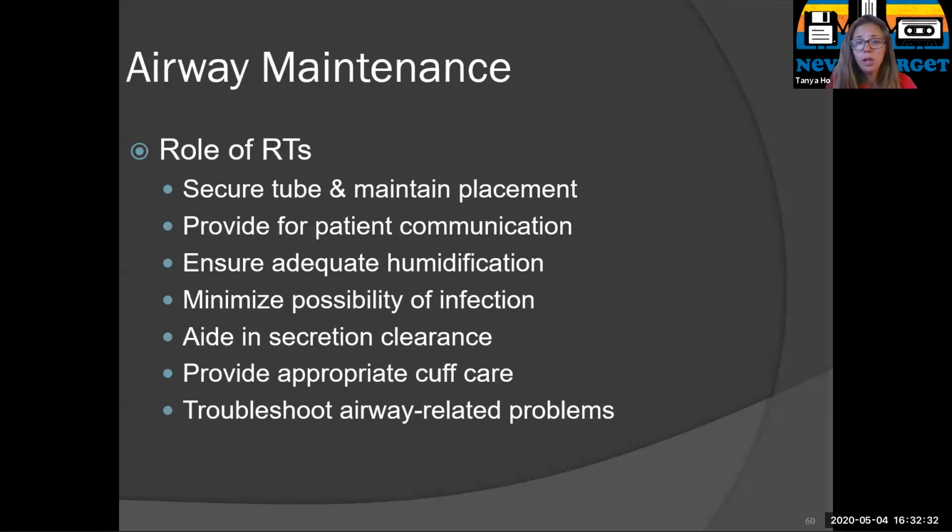Okay, our role is to secure the tube. So we're going to either be performing the intubation or helping with the intubation, one or the other. So we are responsible for all the equipment, no matter who's doing the intubation. Respiratory is always responsible for all of the equipment. So make sure you know your equipment and you know that it's working. Once the tube is in, you will secure it, okay?